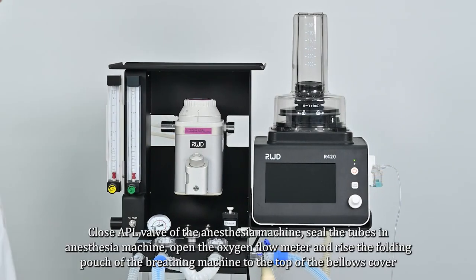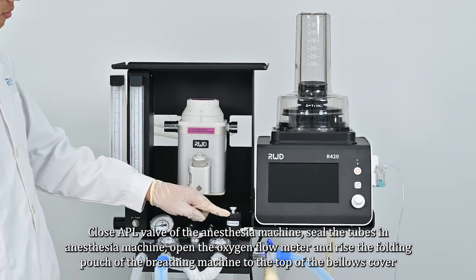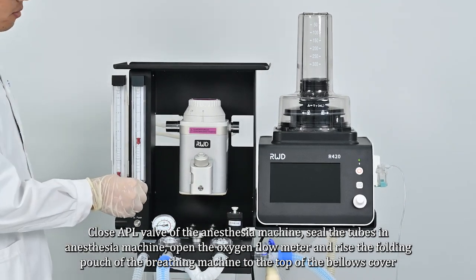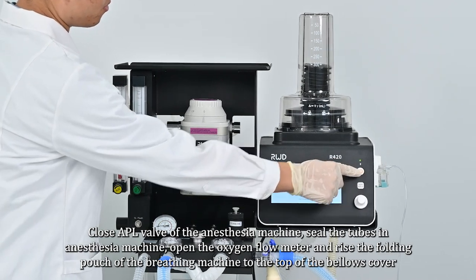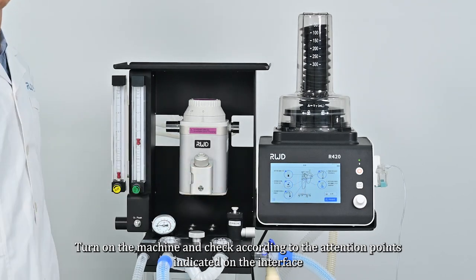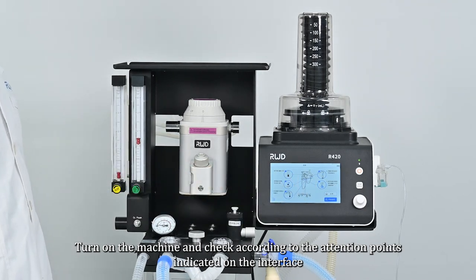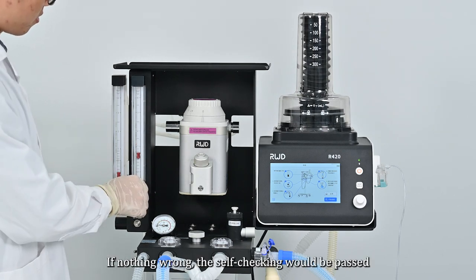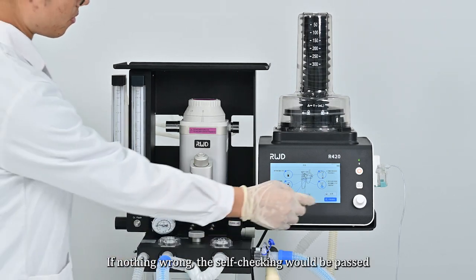Close the adjustable valve of the anesthesia machine and seal the tubes. Open the oxygen flow meter and raise the folding pouch of the breathing machine to the top of the bellows cover. Turn on the machine and check according to the attention points indicated on the interface. Once everything is in good condition, turn on the self-inspection; if nothing is wrong, the self-check will pass.